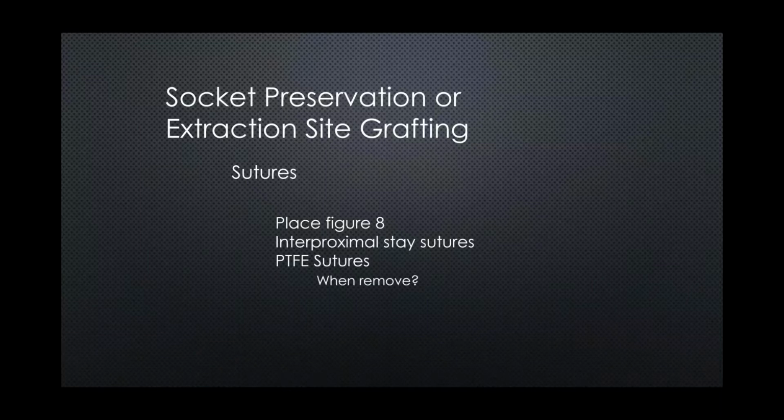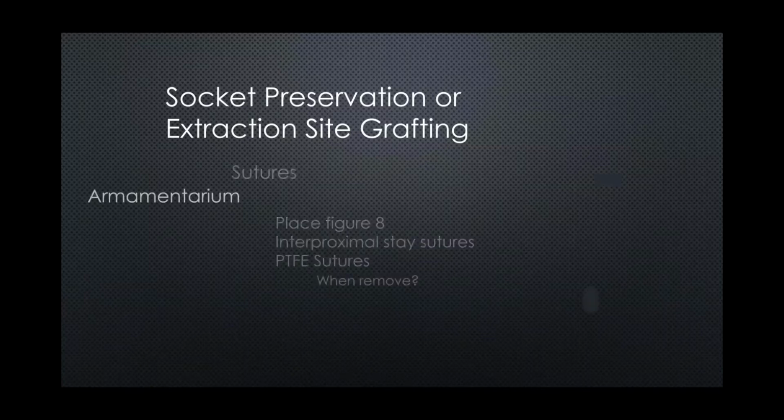So let's think in terms of that mandibular molar that has that 0.5 millimeter or 1 millimeter of attached tissue, as we said before. Taking the tooth out, packing our socket, instead of pulling that buccal tissue all the way to the lingual, we just leave the buccal tissues where they are. We place our bone graft, place our non-resorbable membrane over the top. We don't get primary closure. And what happens now is that over the month or so, we remove our membrane, and we've just generated a whole big band of thick tissue. And I'll show you what that looks like in a second.